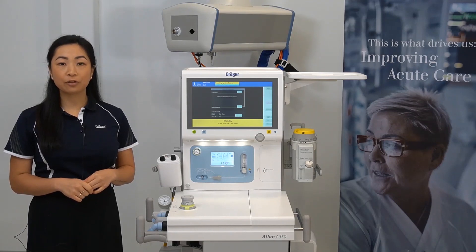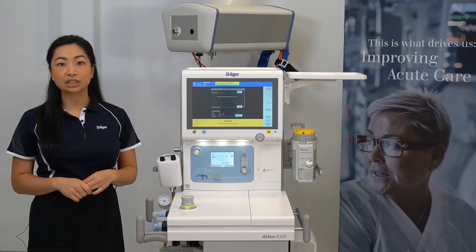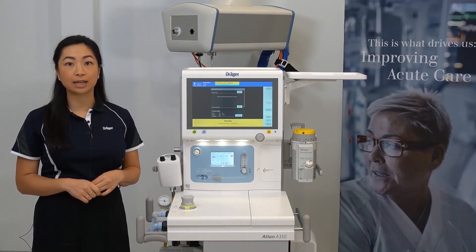For more information, please refer to the instructions for use or contact your local Draeger representative.